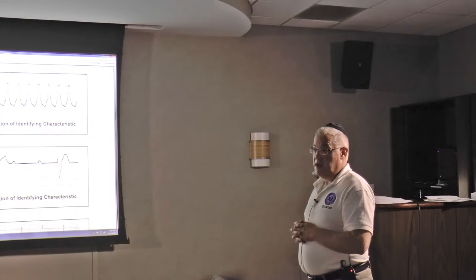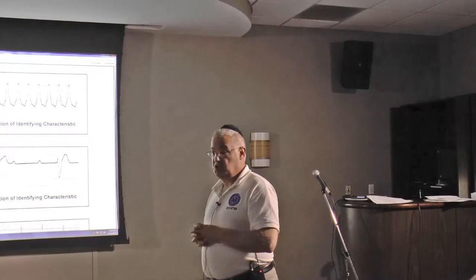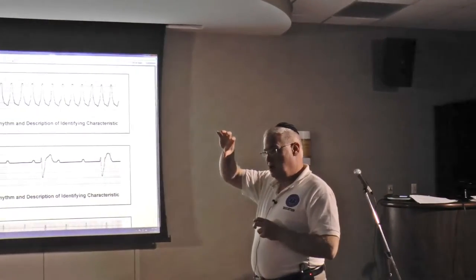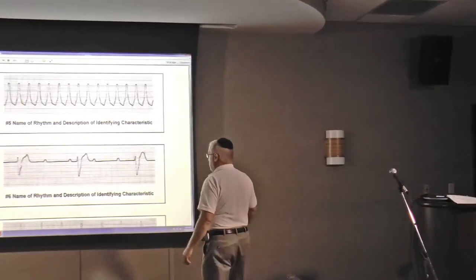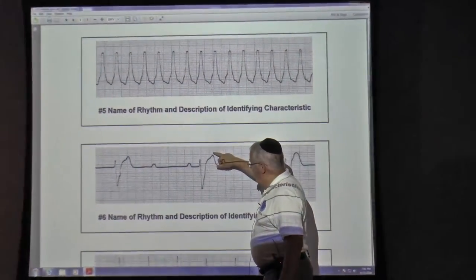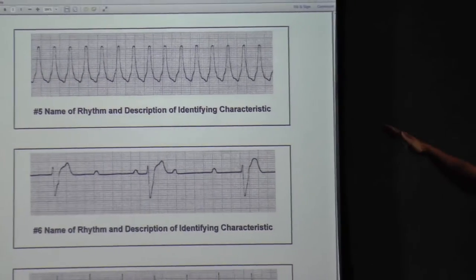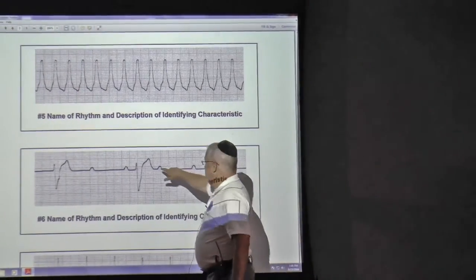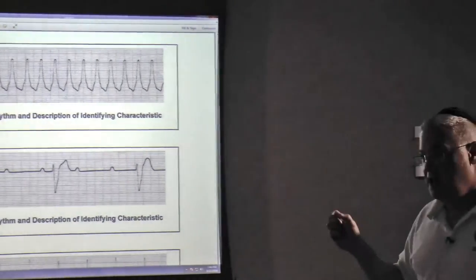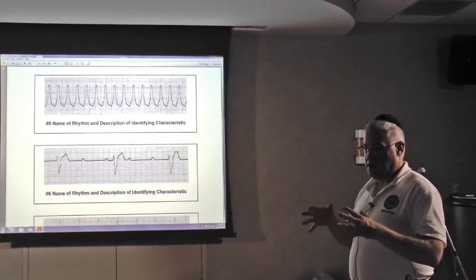If the patient's unstable, technically, the treatment is called synchronized cardioversion, which is a fancier defibrillation. The issue with defibrillation is the shock is administered when we press the trigger. If you remember the first class, we looked at the EKG from the standpoint of what's going on in different parts of the heart. If we draw a line right through the T wave, everything on this side of the T wave is kind of used up. The muscle depolarized, it's used up, nothing could make it stimulate again. On the downslope of the T wave, the heart is repolarizing, getting ready. So technically, it's a 1 in 1,000 or 1 in 1,000,000 chance, if you were to shock somebody in that VTAC on a downslope when it's repolarizing, you could throw the patient into VFib.